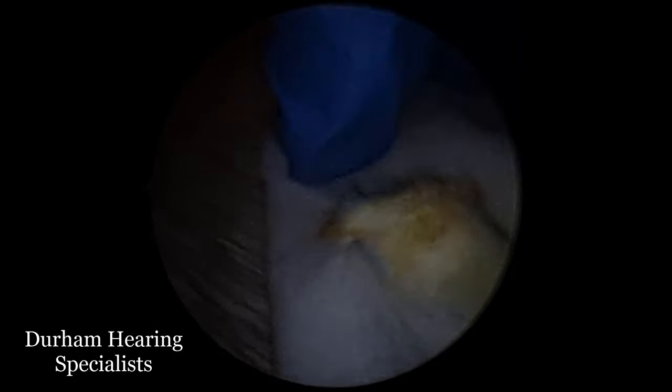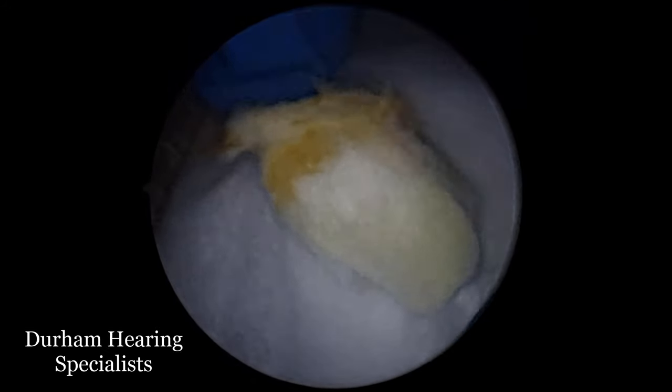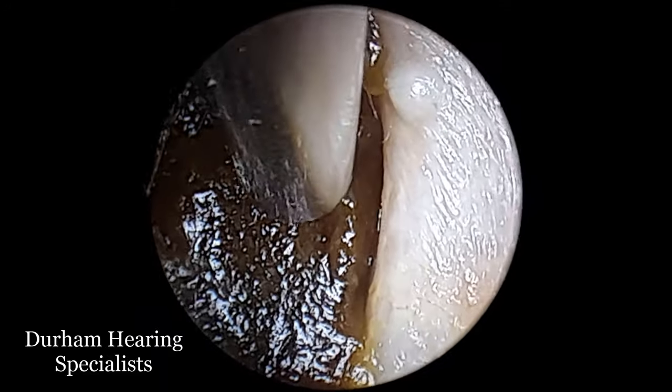But in this particular case, there's just been far too much shoved in there and it's not done the patient any favors. So now what we have is a rather extensive earwax blockage here.